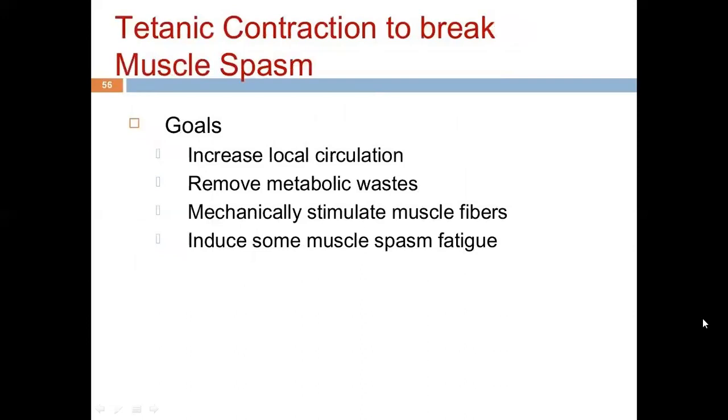Now moving on to the tetanic contraction to break the muscle spasm. Our goals should be to increase the local circulation, to remove metabolic waste, to mechanically stimulate muscle fibers, and to induce some muscle spasm fatigue.